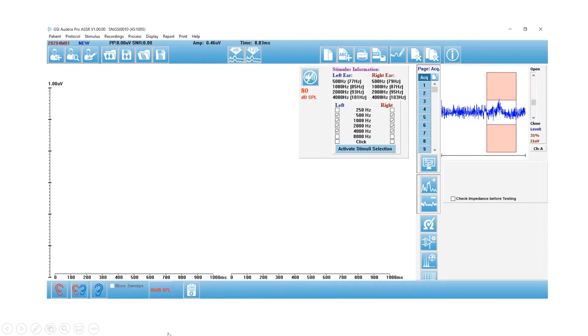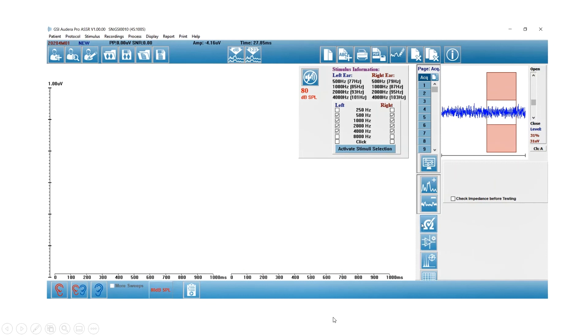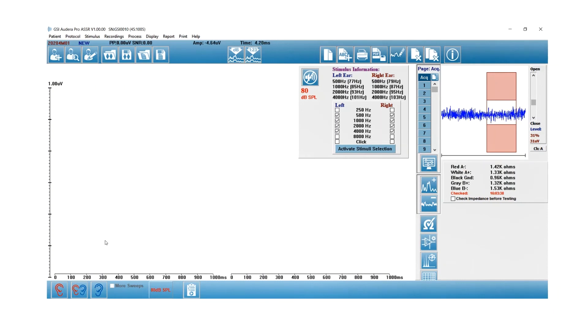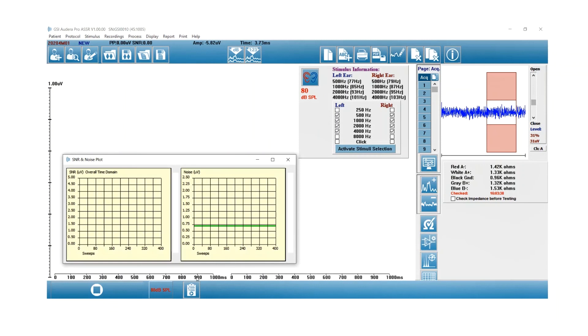I'm going to go ahead and start the video. You can see I've selected the impedance icon and I'm waiting for the impedance to appear. It should be under five kiloohms, just like ABR.